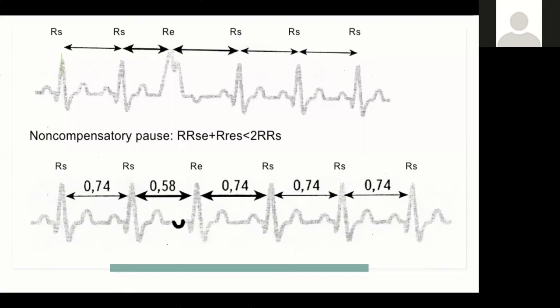The third one. The third one, yes. And is it atrial or ventricular? It's ventricular. Why? Can you tell me why? Because the QRS complex has the problem. Yes, that is correct. I don't know who you are, but great job. I can actually see you. Can you tell me your name? Isaac. Isaac, great. You're correct. So the problem is here, and keep in mind that you need this because ventricular extrasystoles have a complete compensatory pause. It's that simple.